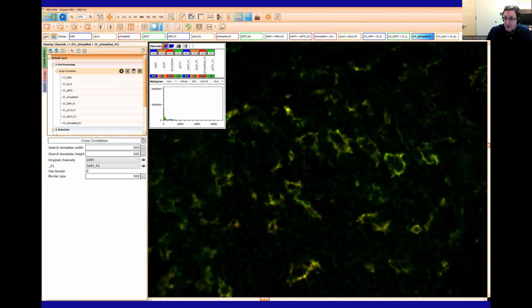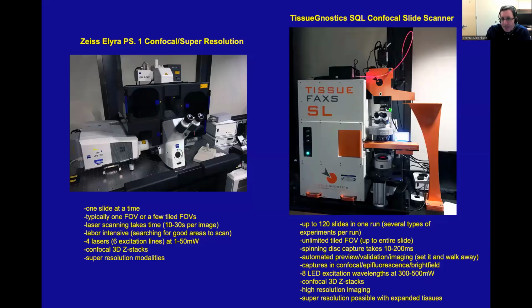So this makes it possible for us, and we could have added a third pass. We could have done a third panel of markers and then built up this map, and it's actually unlimited. We could have done 50 or 100 markers with the same technique. And then once we've done this in the software, we can apply all the tools that StrataQuest offers, that Rupert has probably been talking about, for the quantification of these cells, either in terms of their distribution in tissue or their association with each other or their marker profiles.